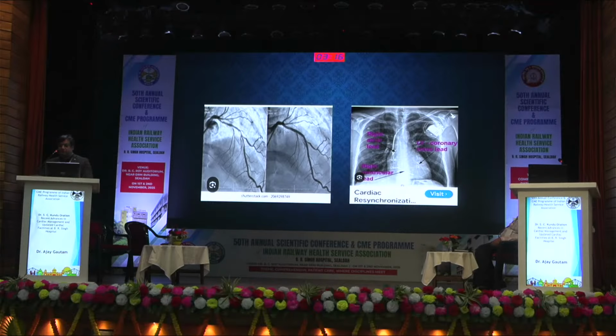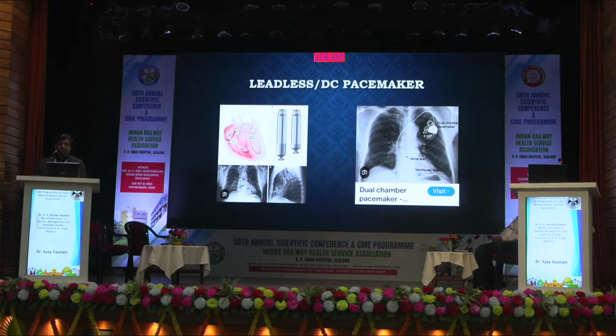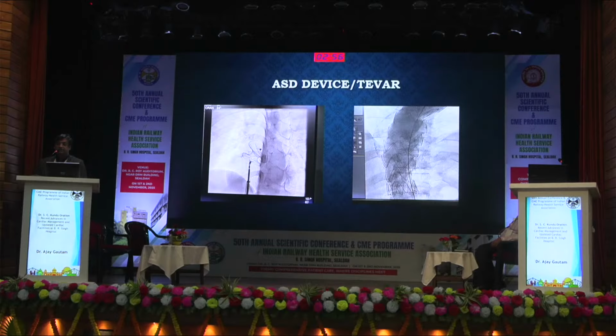Now I will show you some simple slides. This is an LAD artery, left side, and after stenting, there is TIMI-3 flow, good improvement. On the right side is a device which is CRT therapy. You can see 3 leads. Leadless pacemaker on the left side. On the right side, dual chamber pacemaker. ASD device on the left side.